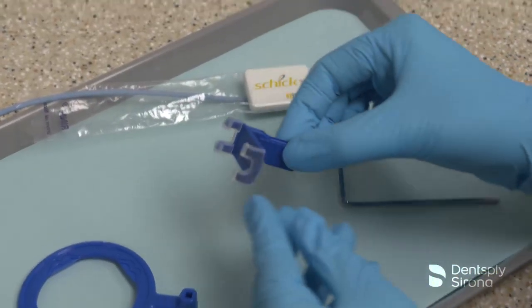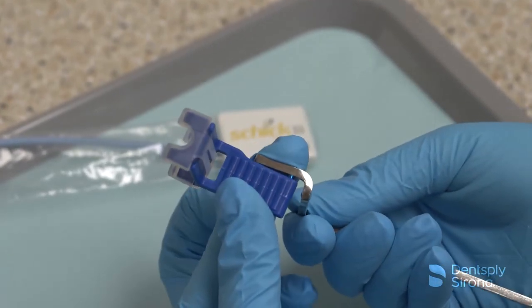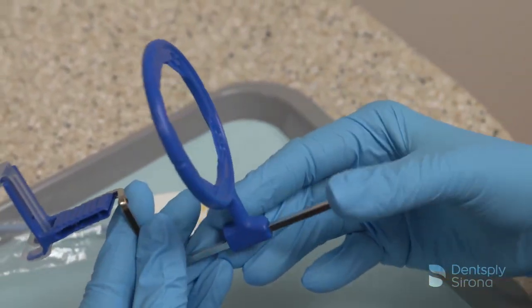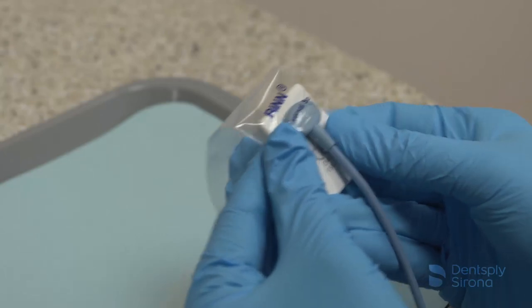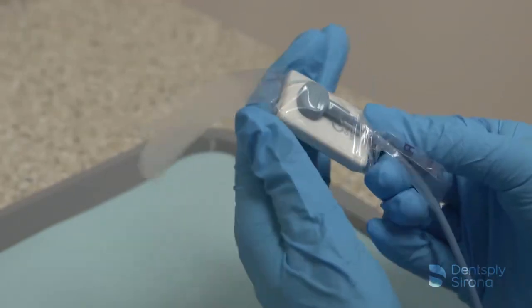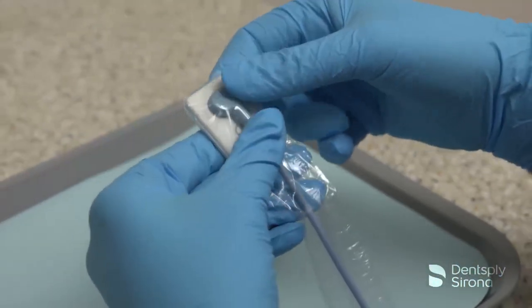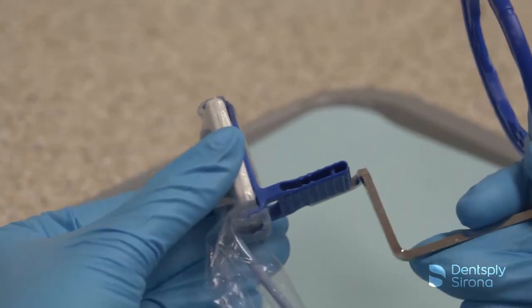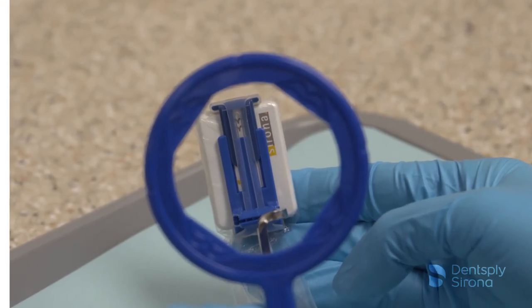To assemble the XCP-DS-Fit anterior bite block, place the blue pins on the arm into the side of the blue bite block and slide the arm into the blue aiming ring. A RIN digital sensor cover is recommended for use with the XCP-DS-Fit universal sensor holder; however, its use does not replace cleaning and disinfection of digital radiology sensors. After placing the sensor into a RIN digital sensor cover, securely insert the sensor vertically into the blue bite block, making sure the active side of the sensor is against the flat surface of the bite block.